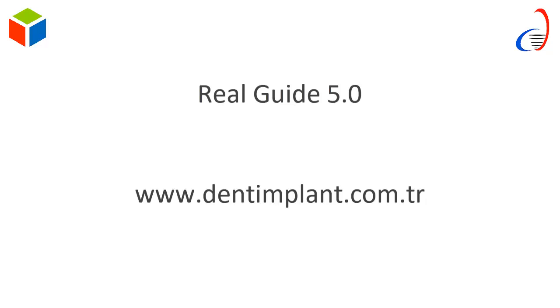CBCT centers generally send data in zip file. The software can import zip file directly, yes. But I think I've already answered this question. Yeah, I think we answered all the questions. Sorry, please. Can I put the segmented tooth into the anatomy model? Yes, you can manage the STL file as you want and put it together with the Boolean operation.